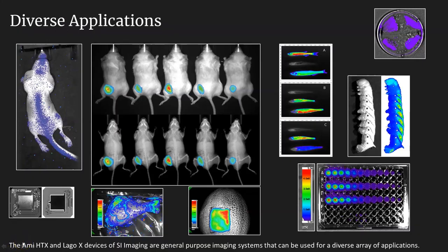Now, typically when one thinks of in vivo optical imaging being applied to preclinical research, one envisions an image such as this, where you have optical data being superimposed onto the white light image of a mouse or rat, or onto the X-ray of a mouse or rat, for the purposes of orientating the location of that optical data. It should be emphasized, however, that there are many other animal model systems and constructs by which in vivo optical imaging can be applied to great use.